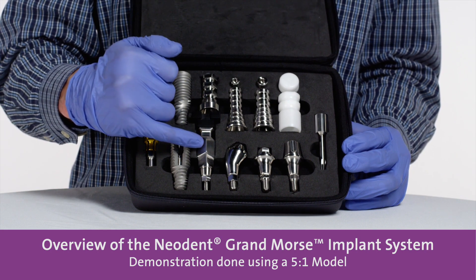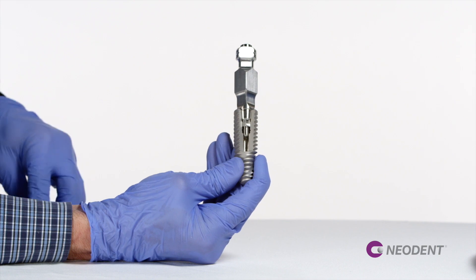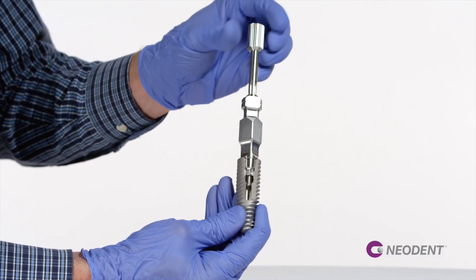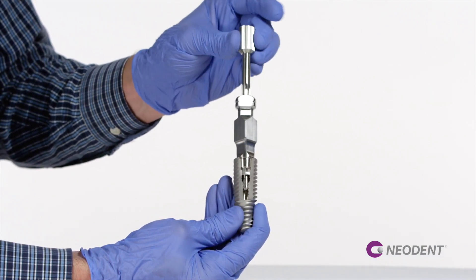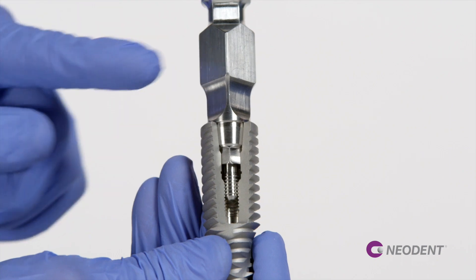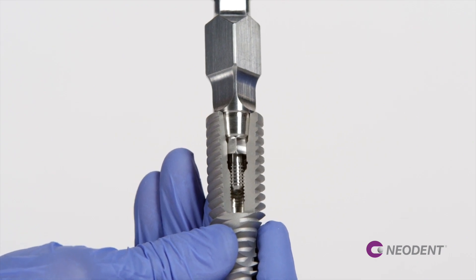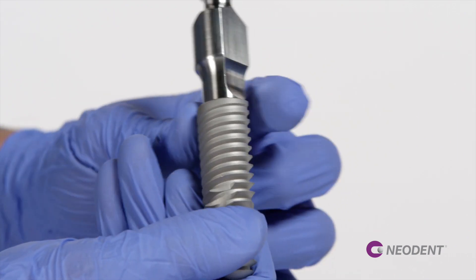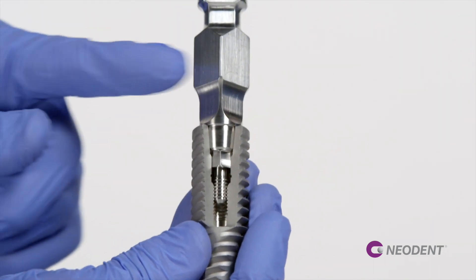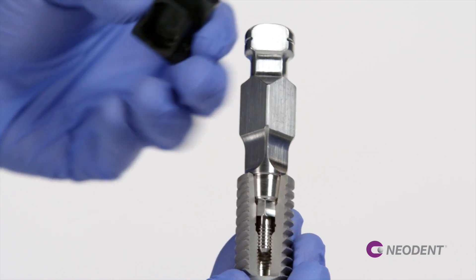This is a macro model of the closed tray impression coping from the implant level with a plastic cap. Once you engage the impression inside the implant with the new driver by hand, you torque it down. You can see in the front part of the impression coping two flat areas where you can easily recognize the right position in your impression to replace it. And in the back you see it's a rounded area. So these two flat areas give you the reference to replace it in the right position. And also we have a plastic cap that you snap on.